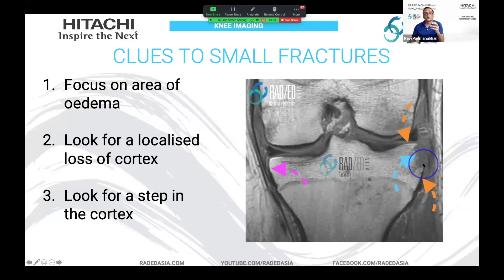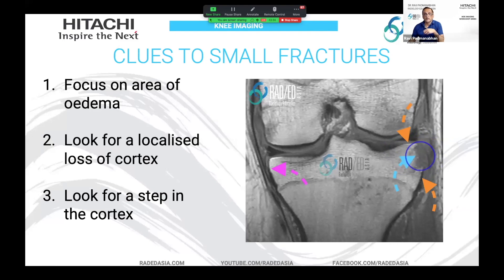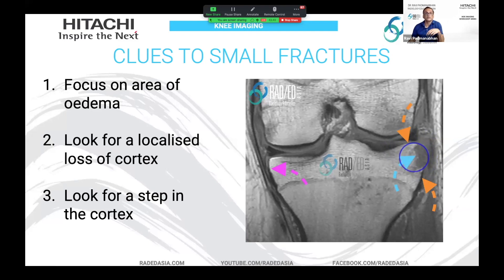With small fractures where you may not see the fragment, the absence of this black cortical line in the region where there's edema is your clue to there being a fracture.